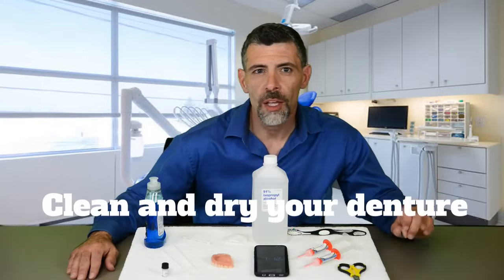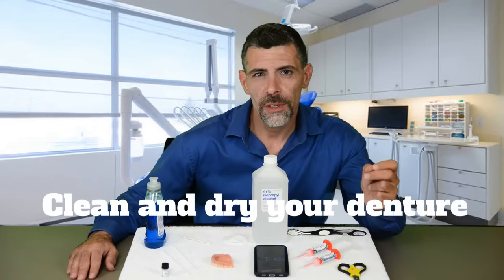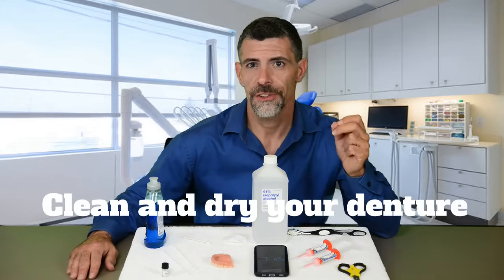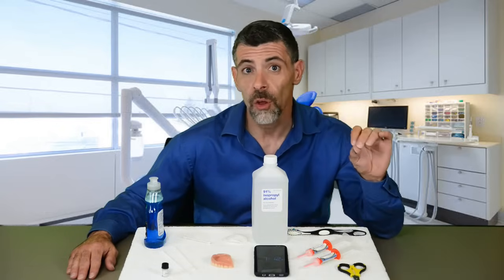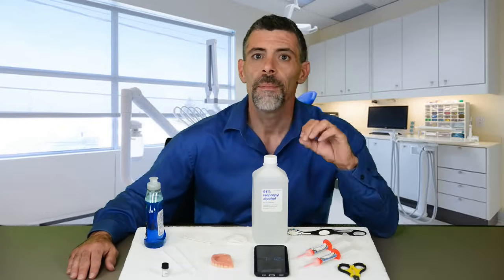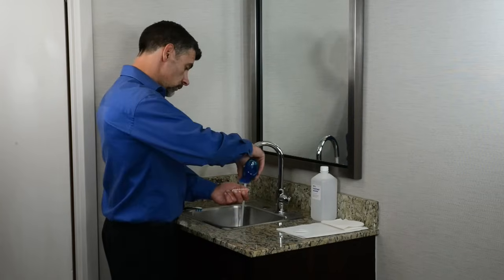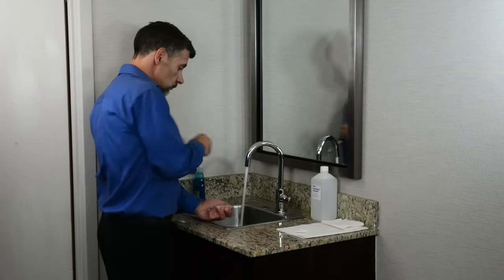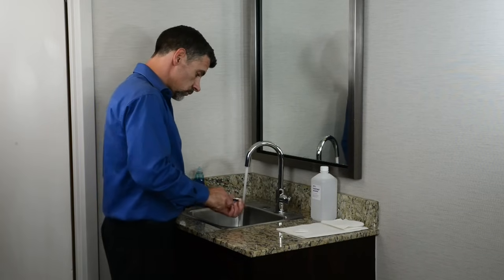It is important to thoroughly clean your denture so that there is no residue from adhesives or anything else on it, because any foreign substance on the surface of your denture will prevent proper adhesion and will cause lifting of the silicone, shortening the life of your liner.